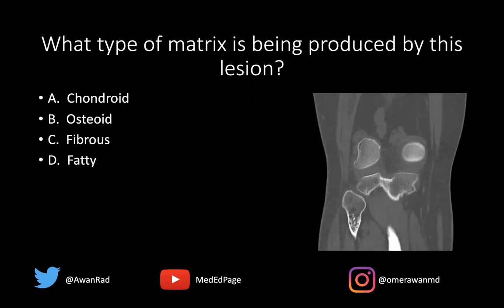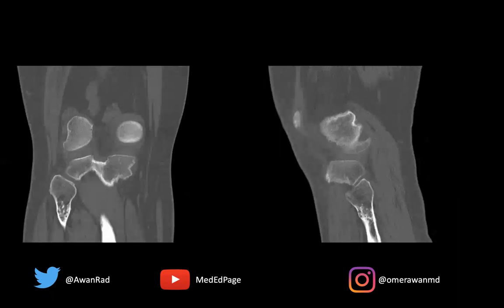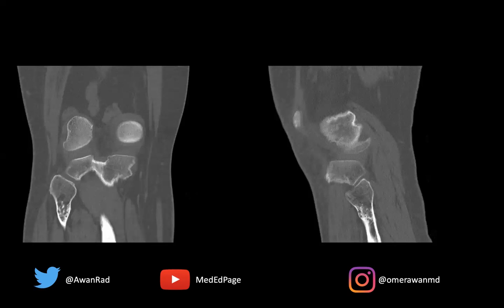Taking a look at this image, notice there is punctate, flocculant increased density — kind of pinpoint density — along the proximal fibular metaphysis. This is very characteristic of cartilage tumors: the rings and arcs matrix mineralization, flocculant, punctate, rings and arcs, stippled type of increased density, which is very typical for a chondroid tumor such as an enchondroma. So the best answer here is chondroid matrix.